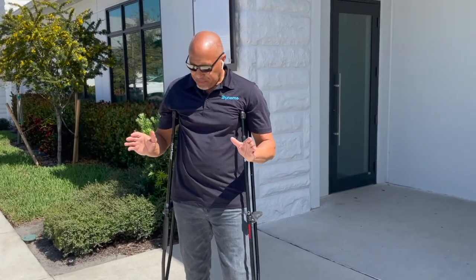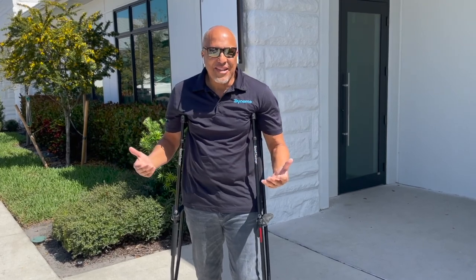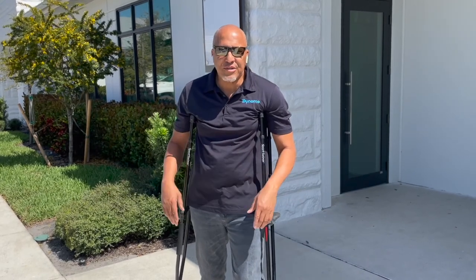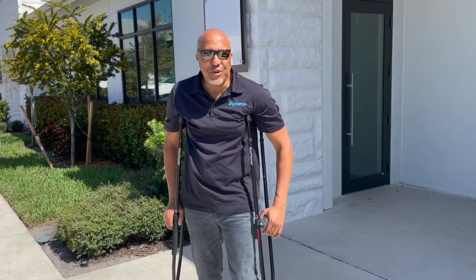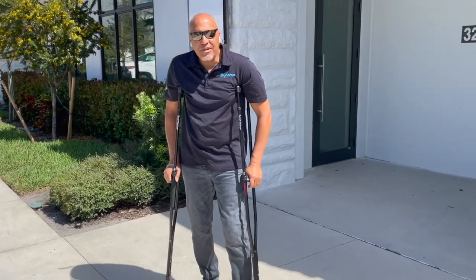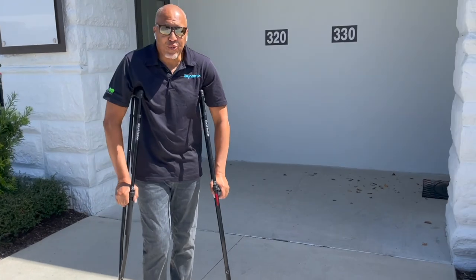Being on crutches, no matter what, is not a pleasant experience — we're trying to make lemonade out of lemons here. I've spent a lot of time on crutches, and a lot worse than crutches too. So let's take these for a stroll — we're here at Dynamo and we're going to take these for a test drive, or in this case a test run.